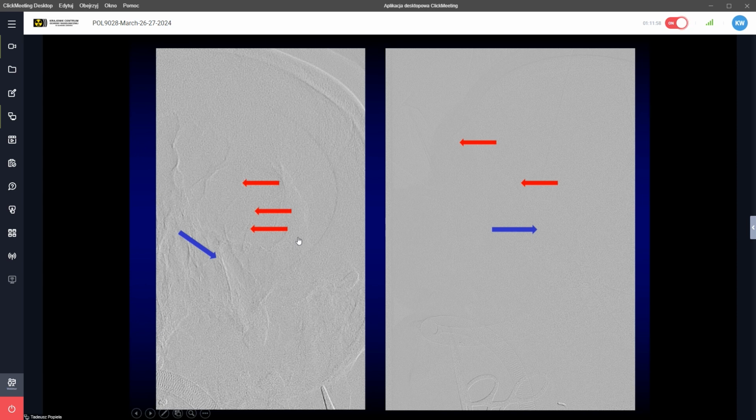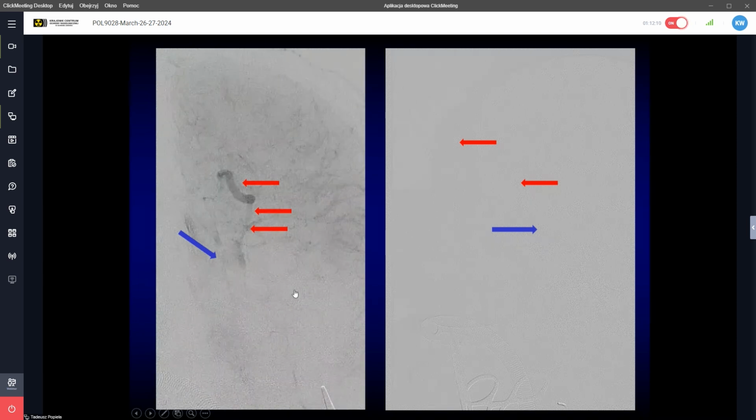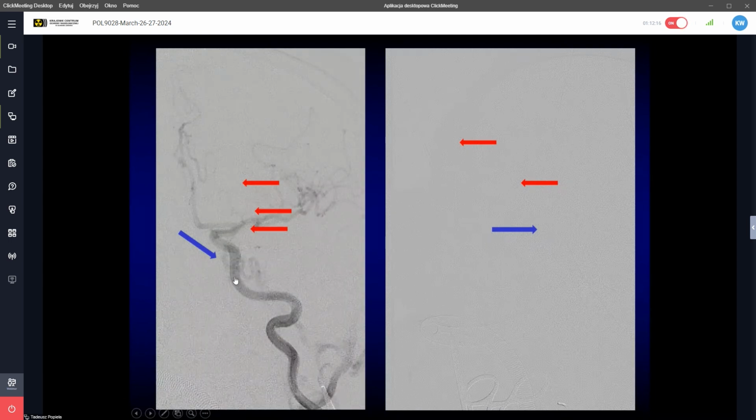In fact, it is the way to get to the lesion. So usually this pathology is mainly for interventionalists. There are several types of this fistula. The most difficult for us is when there is... I must again show the laser point.